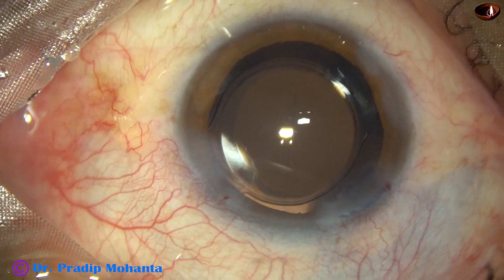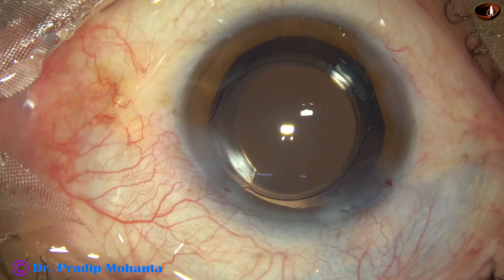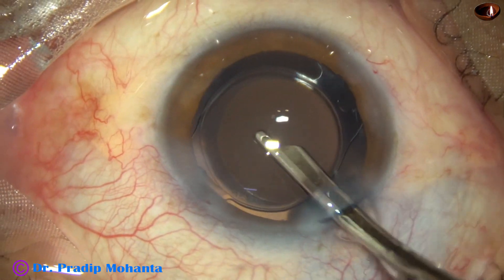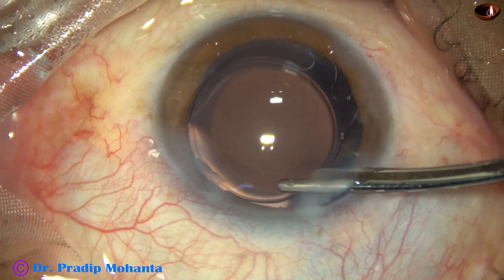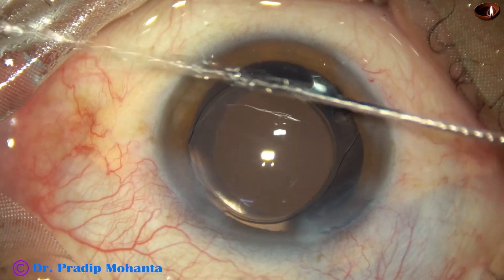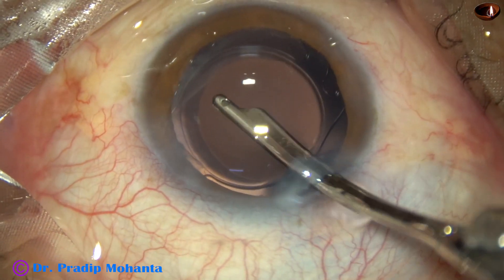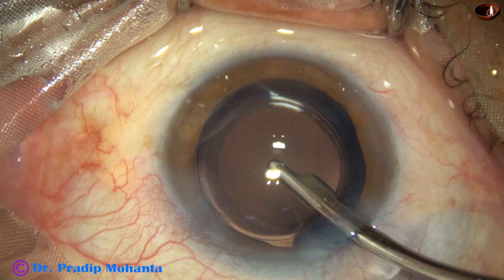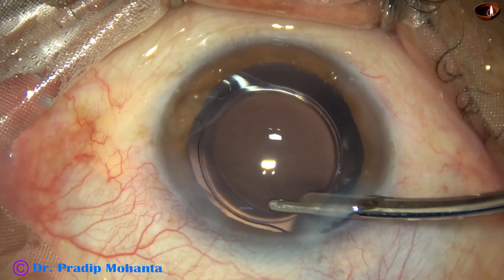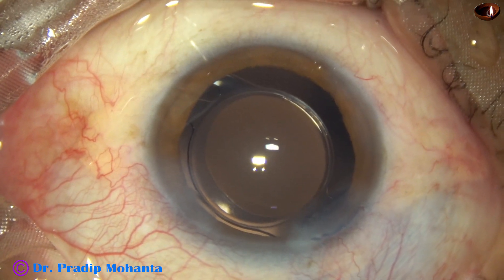The side ports are closed by hydrating the corneal stroma on either side of these stab wounds. Finally, anterior chamber lavage is done with BSS using a 23-gauge Simcoe cannula. The anterior chamber is very nicely formed. Integrity of all the wounds is checked. This is the final lavage of the anterior chamber, and the anterior chamber is nicely formed.